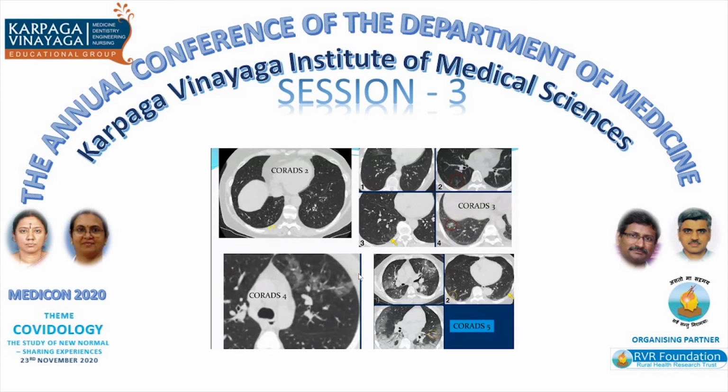And again, to say that this CORADS is not the ultimate, it also depends on the clinical features of the patients, and on how experienced the radiologist is in giving the CORADS. So you have to remember that too.